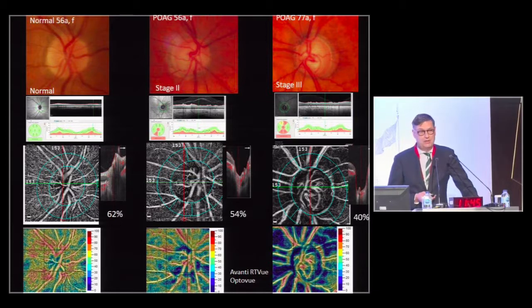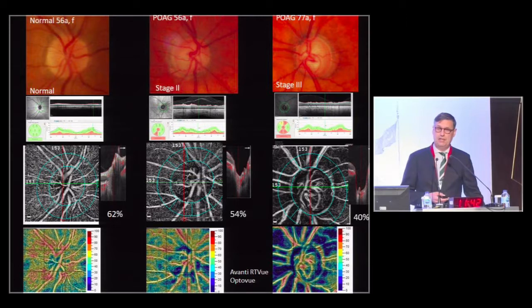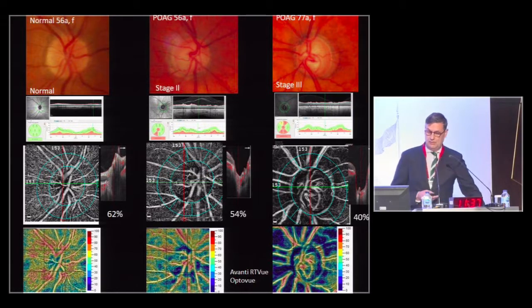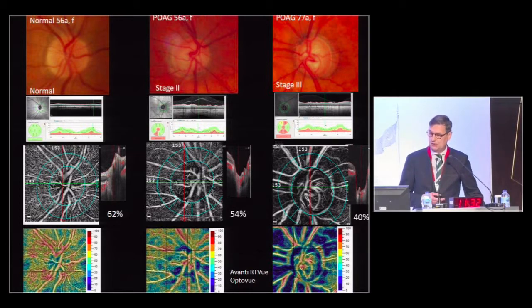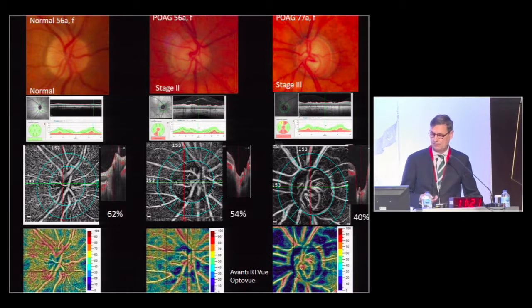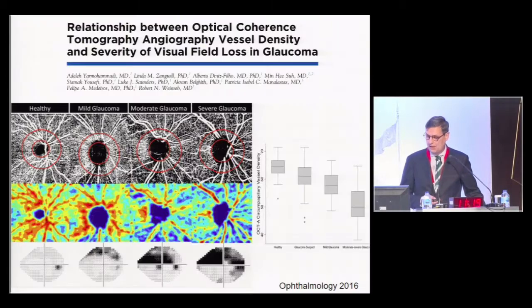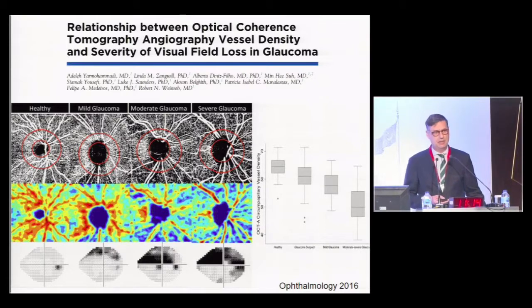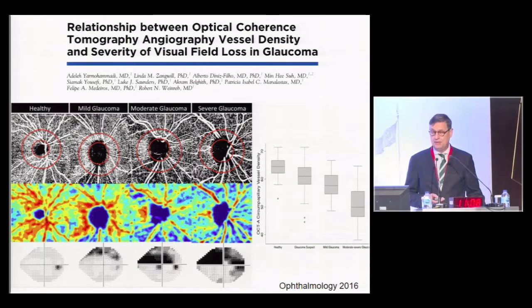With beginning glaucoma stage 2 after Jonas and the thinning of the neuronal rim in the inferior temporal area, you see beginning capillary dropouts in the OCT angio. If the disease continues to a later stage, you see dark areas of capillary dropout in glaucoma. This was described by the group from San Diego in 2016, who nicely correlated the capillary dropout in the superficial layer of the peri-papillary retina with visual field defects.